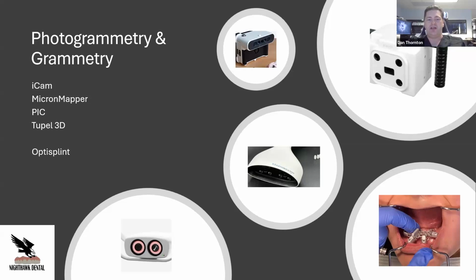It makes it easier to keep track of all that because it instantly comes in and you can instantly put it into your system. You don't have to wait for model work. You don't have to wait for a soft tissue model to set up. You don't have to wait for all the articulators to be ready for you to mount cases to start getting them moving along. You don't have to wait for denture teeth to come in. You have all your stuff already with you in your computer, your design stations.